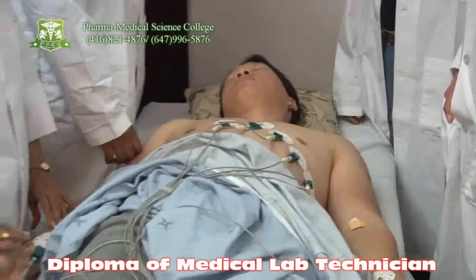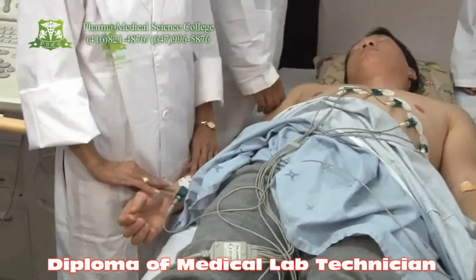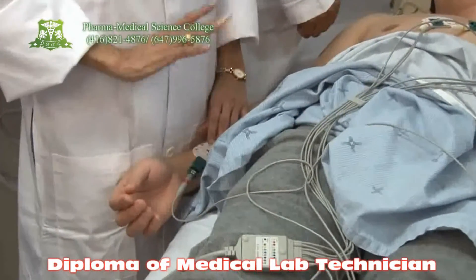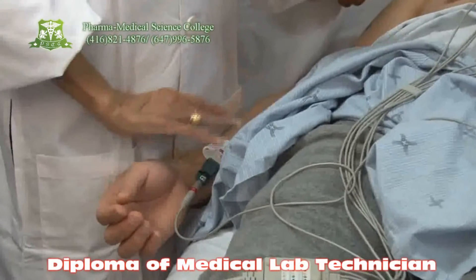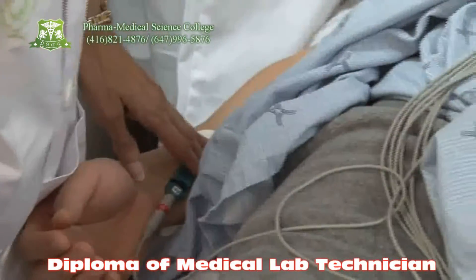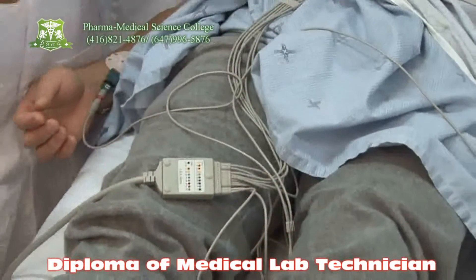At the same time, make sure that you put your electrodes on the hands and that the skin is clean and free from any cream or any powder. That is very important, otherwise the electrode will not stick to the skin. Similarly, on the legs, you have to find your left leg and right leg and put your electrode there.